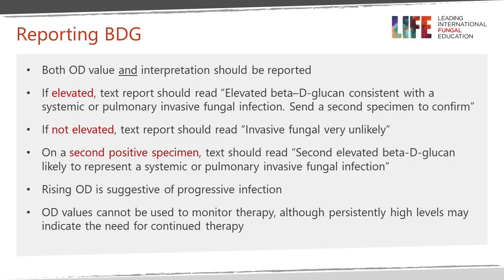So when the laboratory reports a BDG, both the value should be reported as well as the interpretation. Different tests have different cutoffs, and there have been suggestions in the literature about different cutoffs. I'm not going to address the precision of those cutoffs today, but assume that you would be using the manufacturer's cutoff unless you have a good reason not to.